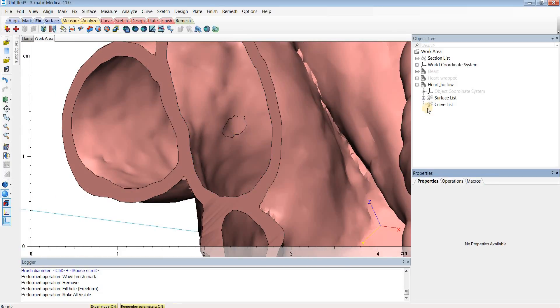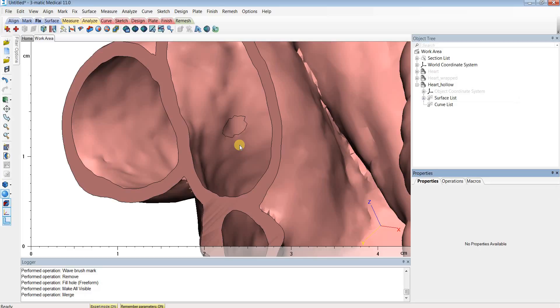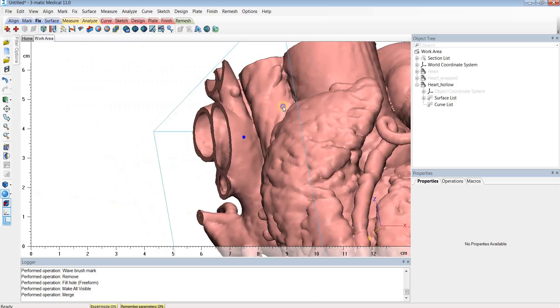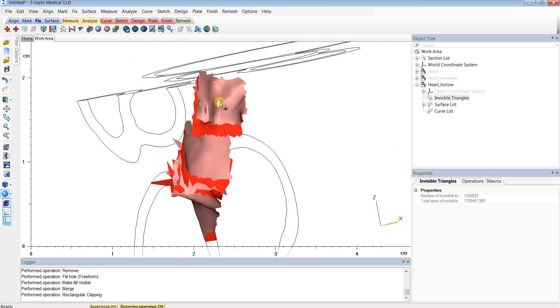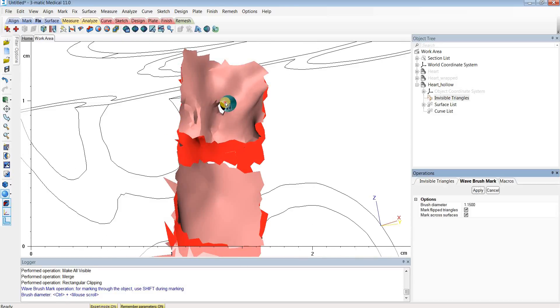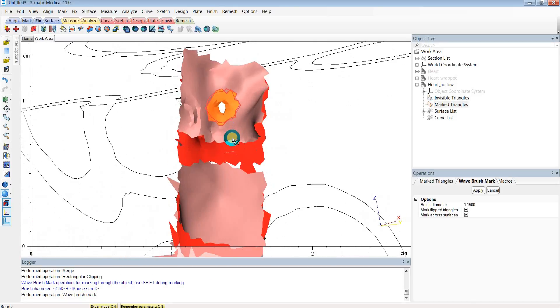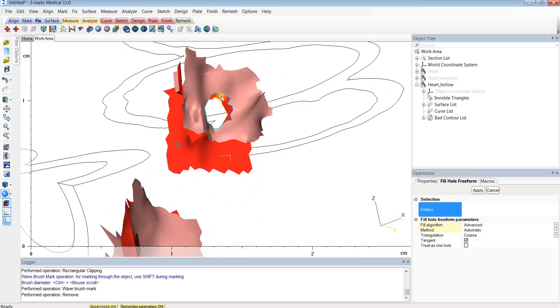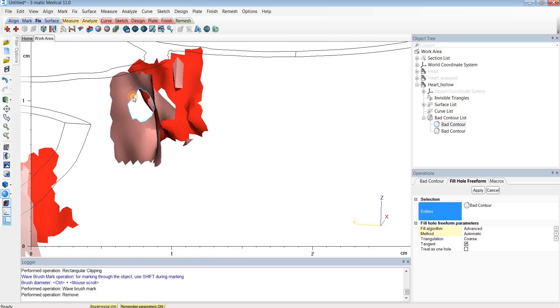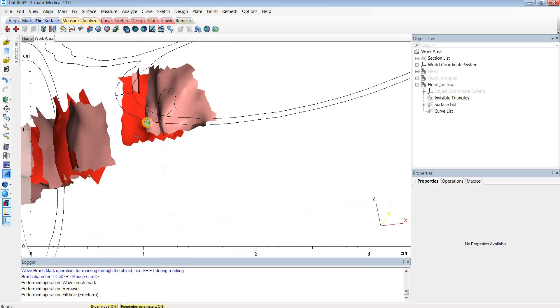If you want to combine these surfaces so you don't see those black lines, right-click on Surface List and merge all those surfaces into the set. Let's run through that one more time on one of the other holes. Again, use the rectangular clipping to isolate the region, hit M to bring up Wave Brush Mark, hold Shift and left-click to mark the region, hit Delete, then go to Fill Hole Freeform, select both contours, and hit Apply. Repeat this process for any other small holes in your model.